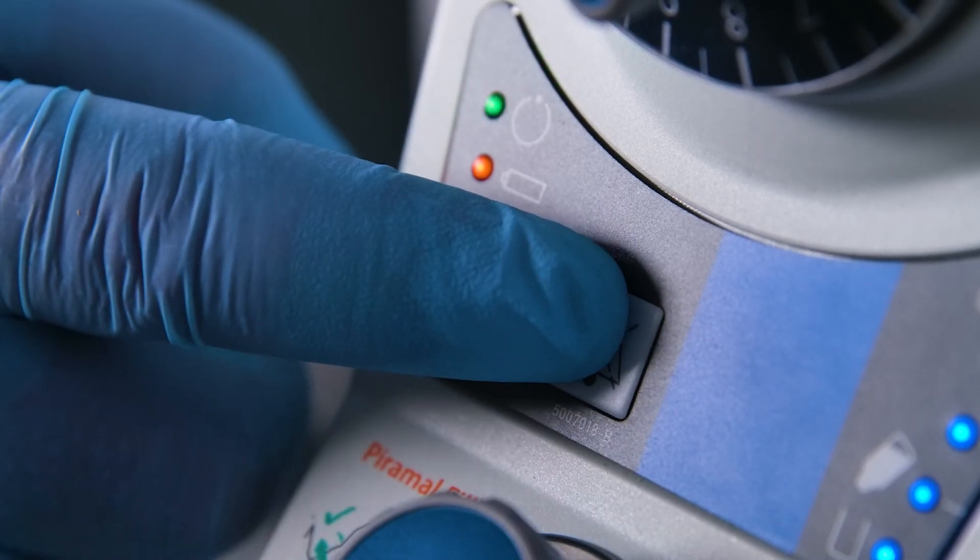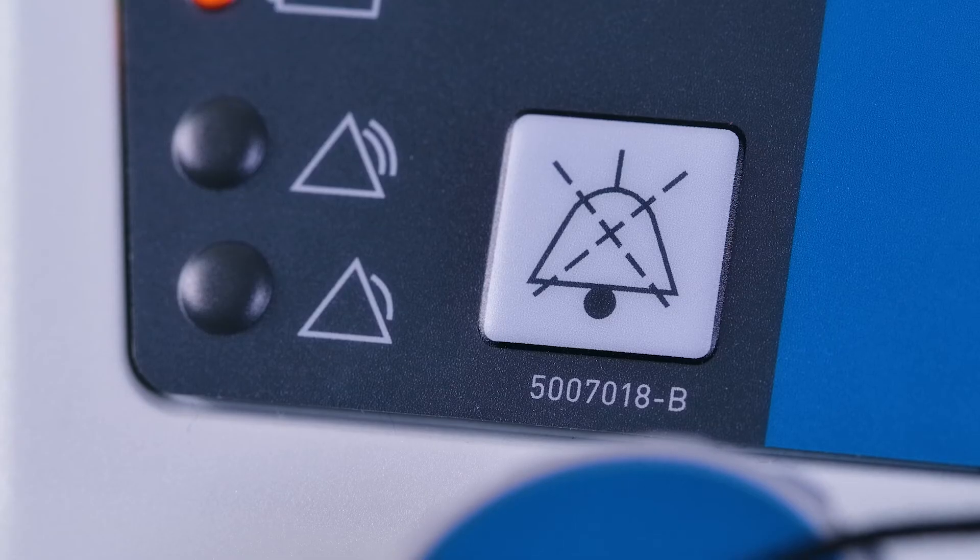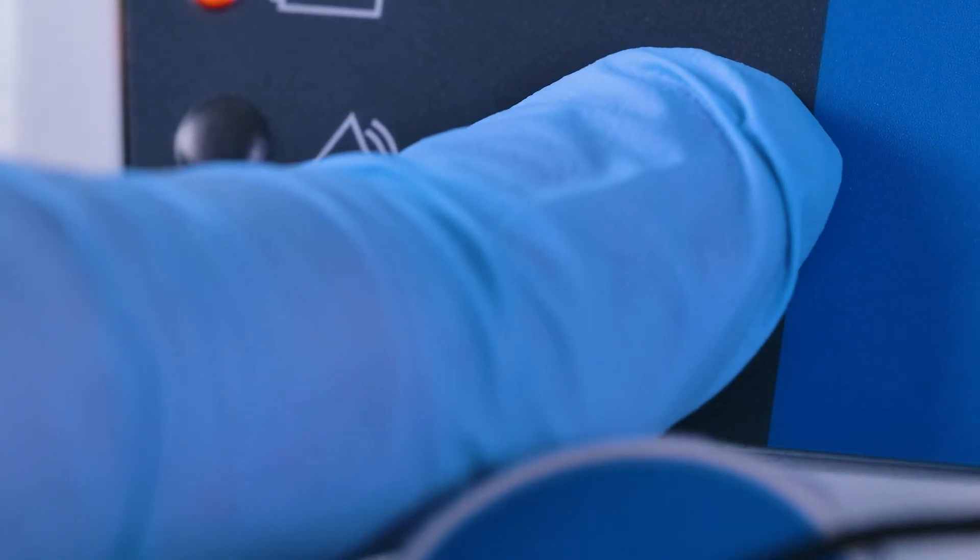Using the alarm mute control. Press the audible alarm mute control. The audible alarm will be silenced for 2 minutes. Press the control again to cancel the silence command.